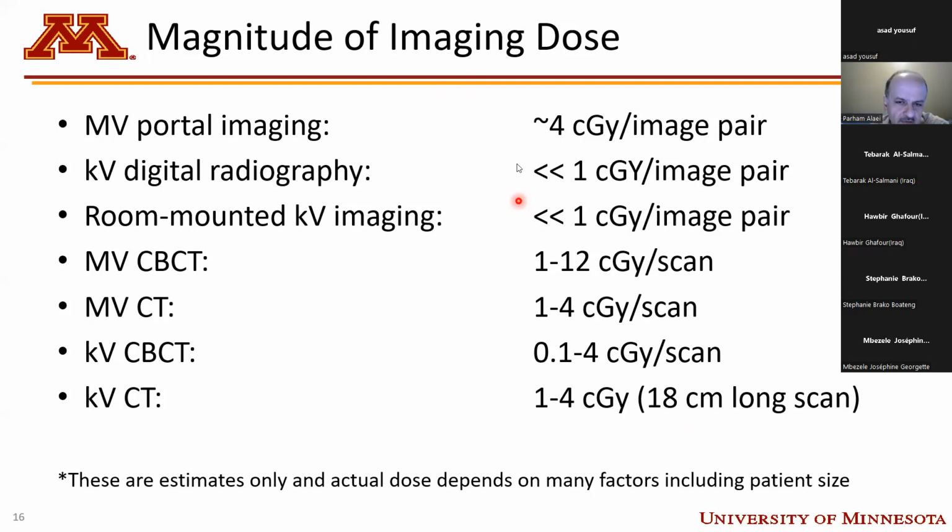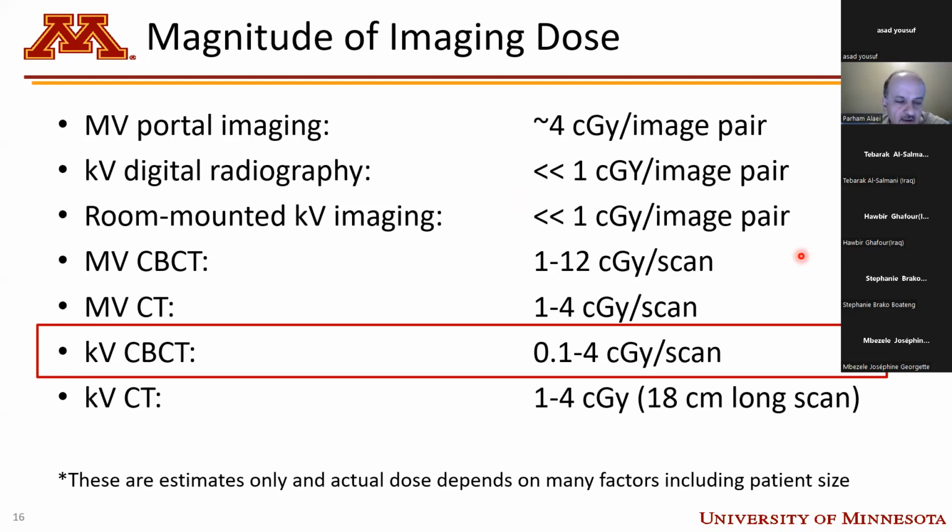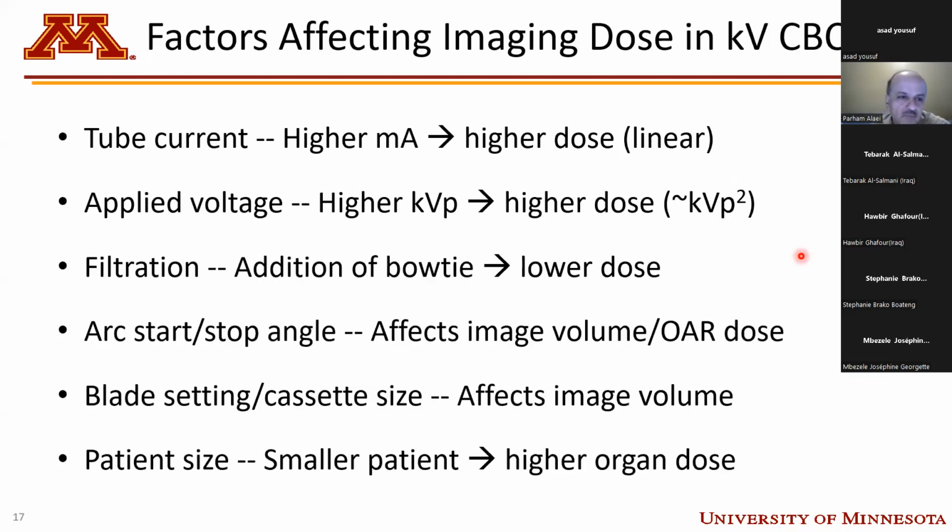Like if a physician asks me what the kilovoltage cone beam dose is for a pelvis scan, I say, well, it's about 3 to 4 centigray. Again, it's just a guideline and a ballpark value. Kilovoltage cone beam, I highlight it here, has a wide range of imaging dose.